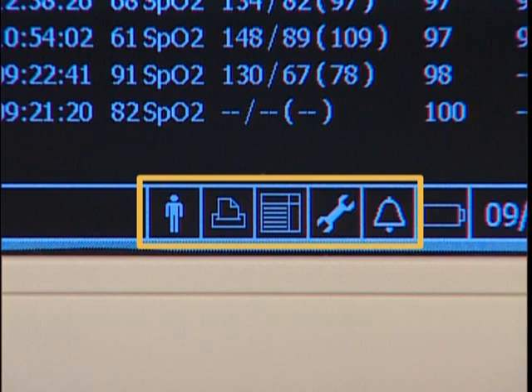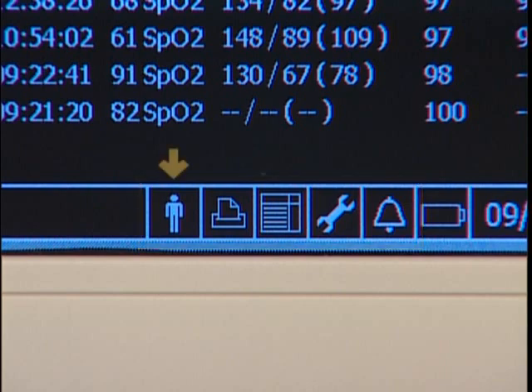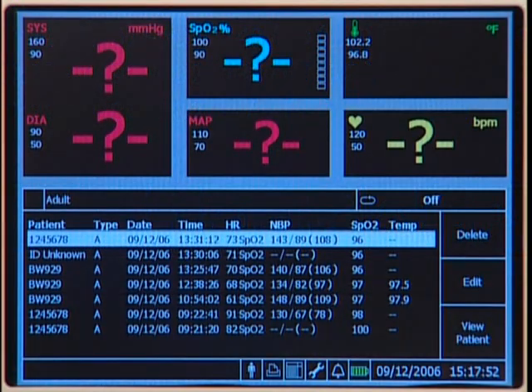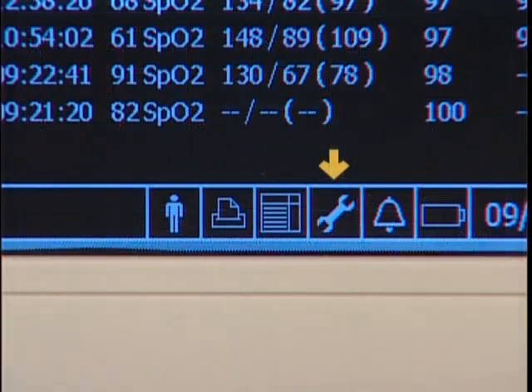These icons provide access to menus that control other functions. This icon is used to open the new patient menu. The printer icon opens the print patient data menu. Highlight this icon to display patient records, hide patient records, or display the SpO2 waveform. This icon opens the system menu. This icon provides access to the alarm menu.